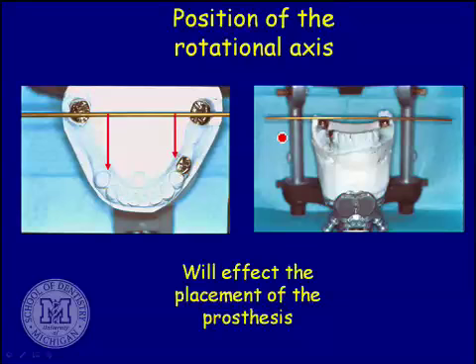So the height up and down of the posterior teeth you're rotating around also matters. Because if they're at the same height, things are made level. You seat the posterior part, you rock it down. Your arc of seating is fairly straight down. If the two teeth at the back that you're using as your primary rest are significantly not level in height, so the plane runs this way, can you see when it arcs forward, it's going to arc that way?